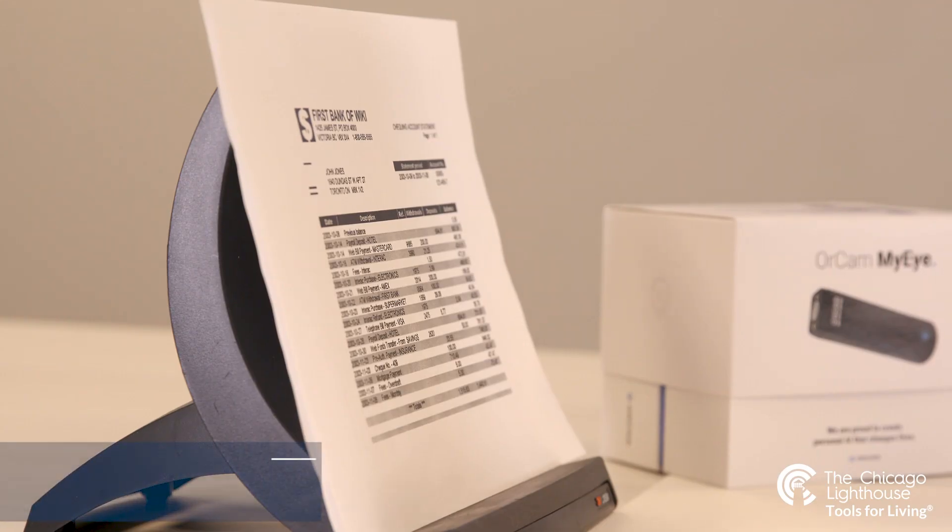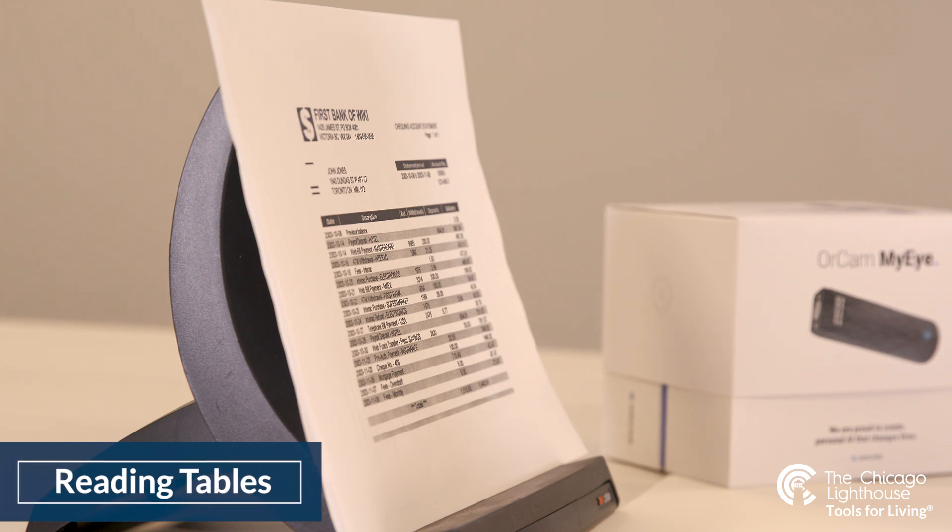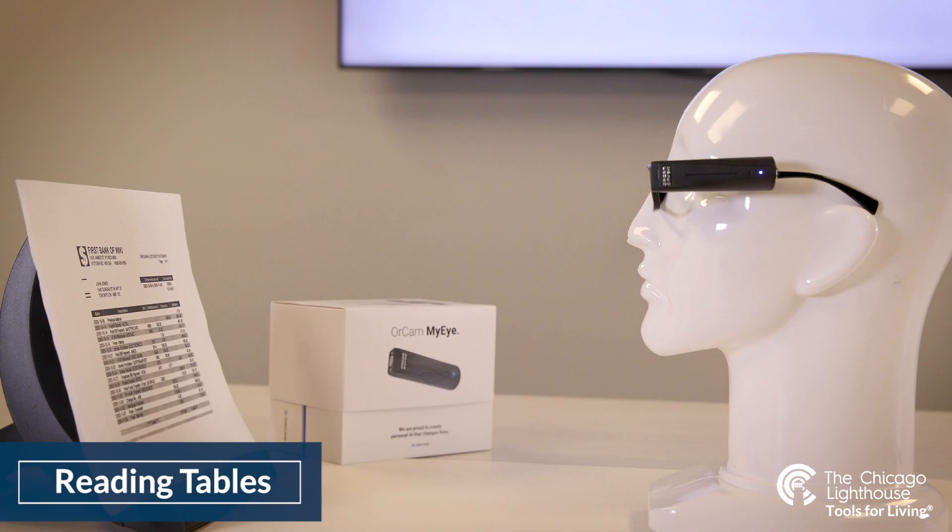The latest feature added to the OrCam is the ability to identify and read tables. This feature is one of the most difficult things to accomplish as an OCR device, so it's sure to grow into a stronger feature as time moves on. To accomplish table reading, you simply take a full-page photo of your table and it should automatically identify and read it row by row. This can help users better understand documents such as receipts or restaurant menus that have table-like formats.